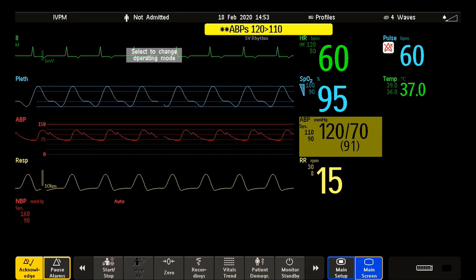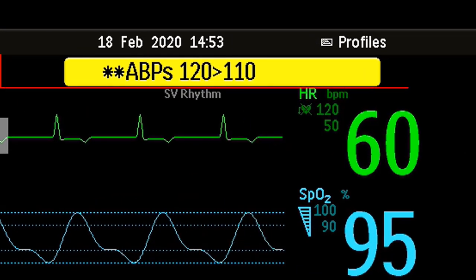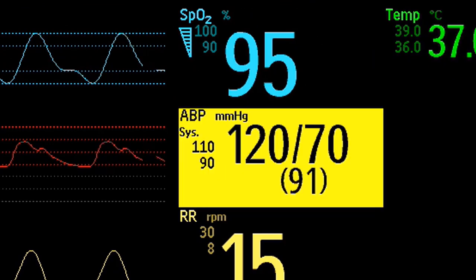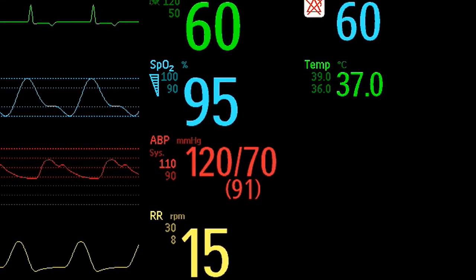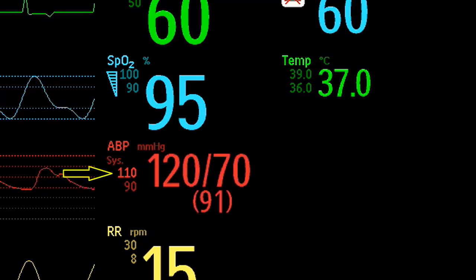An alarm message text appears on the alarm status area at the top of the screen, indicating the source of the alarm. Your monitor can be set up to display a flashing numeric when the alarm comes from a measurement on the screen. It is also possible that your monitor displays the corresponding alarm limit more brightly if the alarm is triggered by an alarm limit violation.